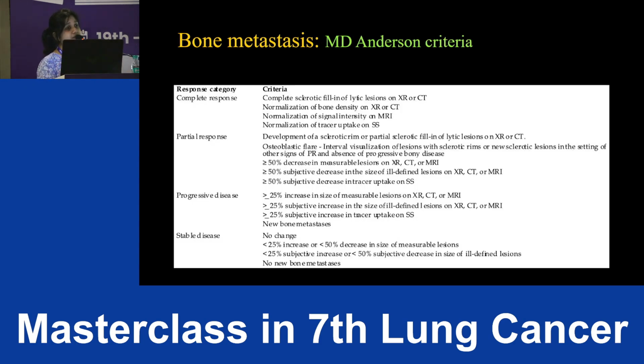But the most important criteria that we actually should be using for bone metastasis is MD Anderson criteria. In MD Anderson criteria for bone metastasis, the lytic and sclerotic lesions are also measured, and they are also measurable lesions. So for complete response, if there's a complete sclerotic fill-in of the lytic lesions on a radiograph or a CT, or if there's a normalization of bone density on radiograph or CT, or normalization of signal intensity on MR, normalization of tracer uptake, then it's a complete response.